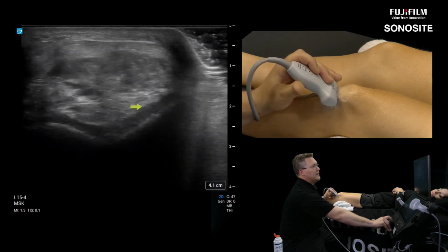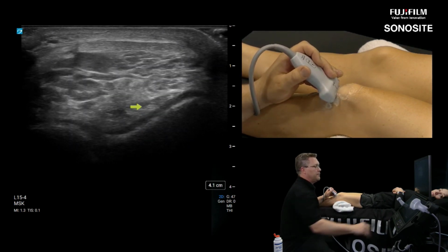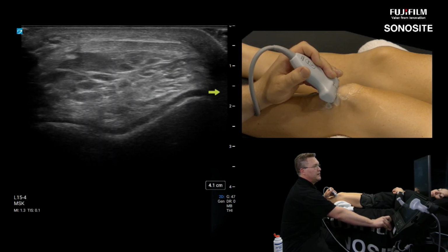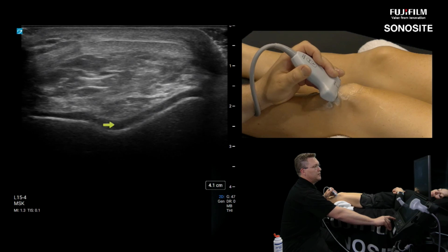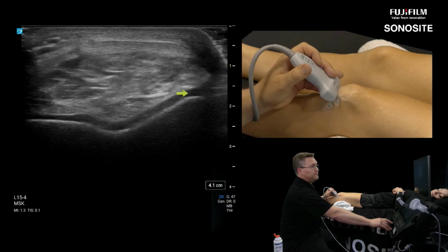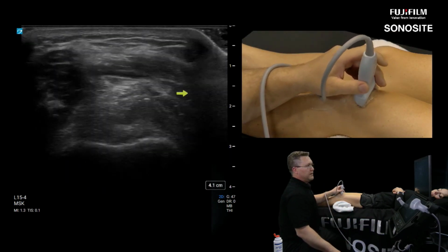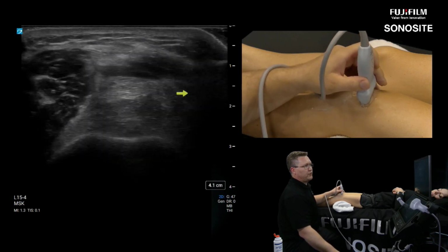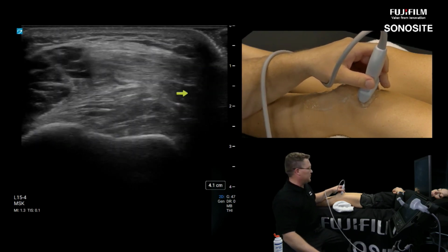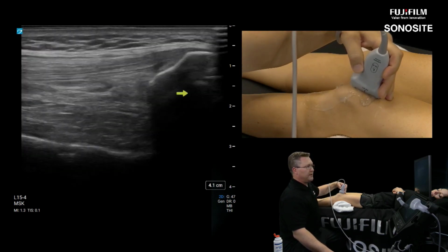There's a published technique to come in this view laterally and slip the needle just over the cartilage and inject. They show that if it balls up around the needle, it's a miss. If it follows the plane of the cartilage, then it's a direct hit of the recess, which is true. But they also only went to that approach if the lateral gutter of the suprapatellar recess was dry. Those authors specifically mentioned only going infrapatellar like this when suprapatellar didn't give confidence.